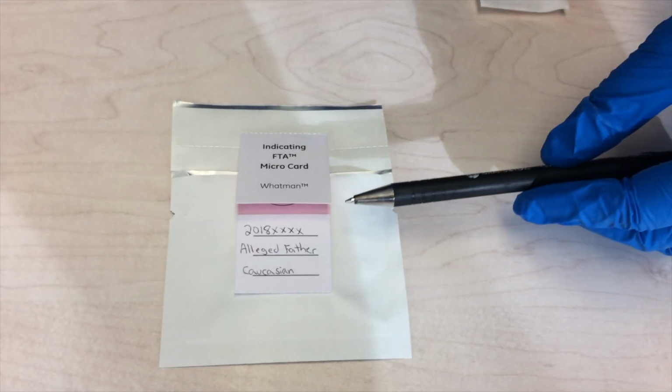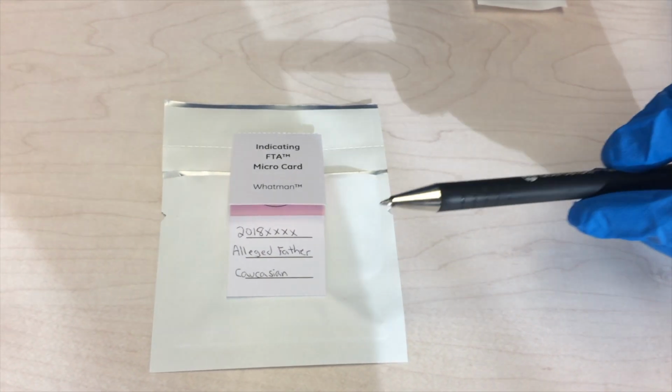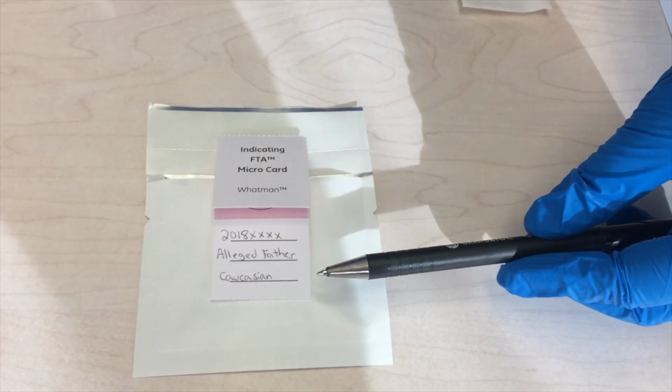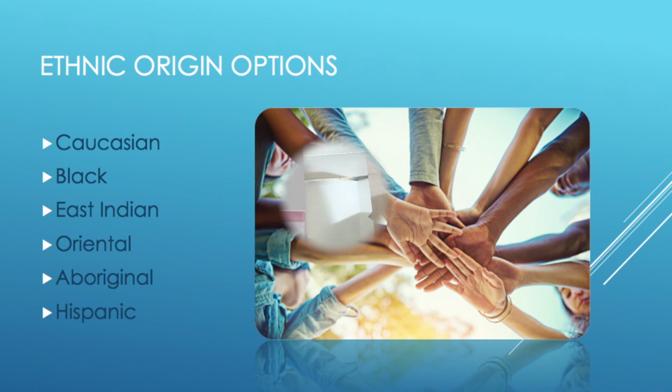On the lines at the bottom of the FTA sample card, write your personal file number, the donor status, for example, the mother or alleged father, and the ethnic origin must be included for the alleged father's sample. For the alleged father's sample, please select one of the following ethnic origins: Caucasian, Black, East Indian, Oriental, Aboriginal, or Hispanic. Ethnic origin is only used for the purpose of statistical calculations. If you choose not to provide your ethnic origin, a default database will be used and indicated in your report.